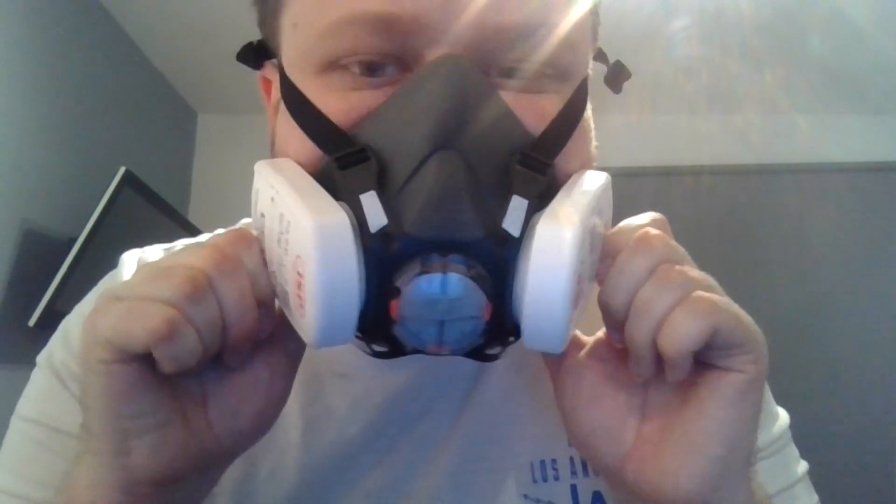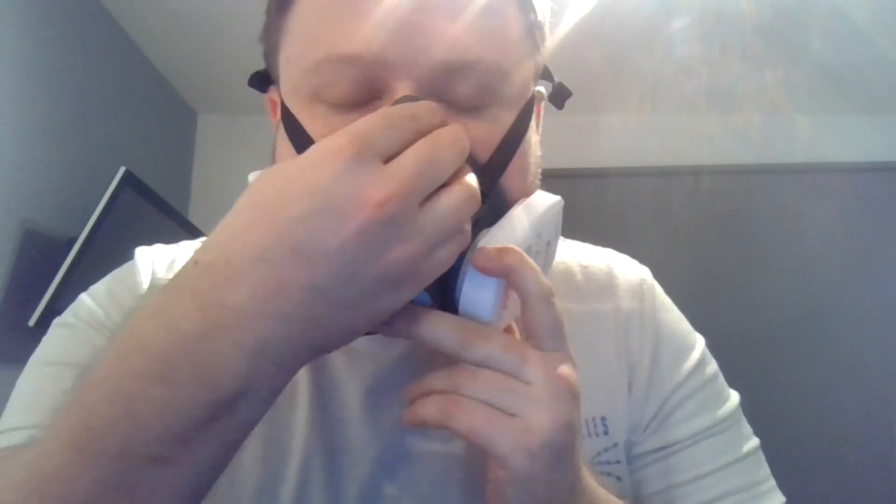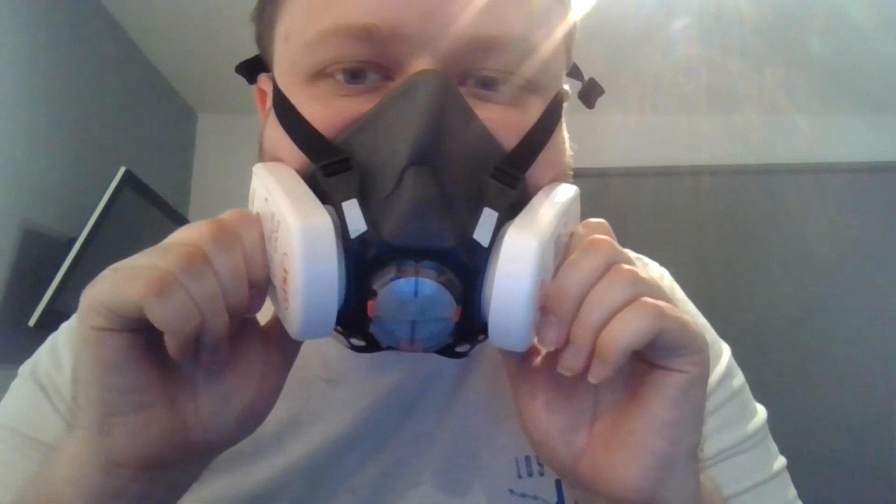Get those straps tight around your head. I've got a massive head so I don't need as much adjustment, but if you've got a smaller head you might need to do more. These are press-to-check filters — press them in and breathe. Now, if you hear air coming in around the mask then it's no good; your face fit isn't right and you need to make some adjustments. Move the mask up and down on your face until you get that perfect fix, because without a good fit you'll be breathing in dirty air.